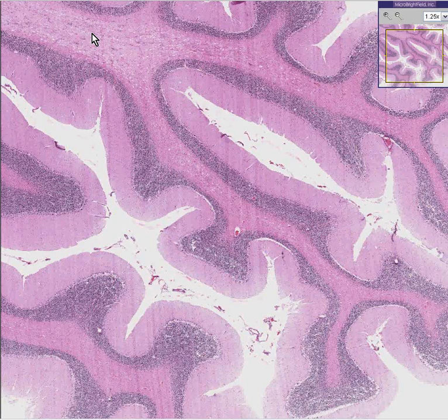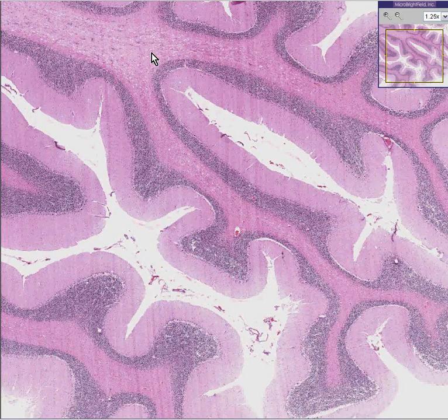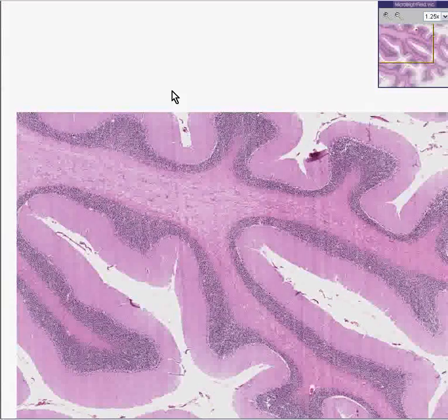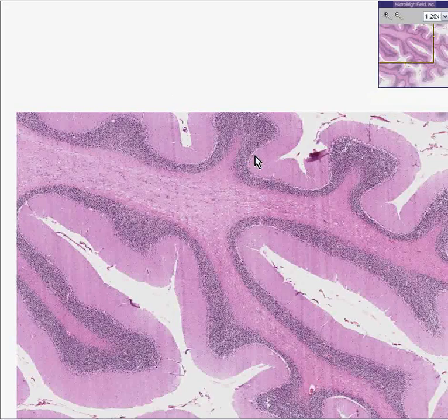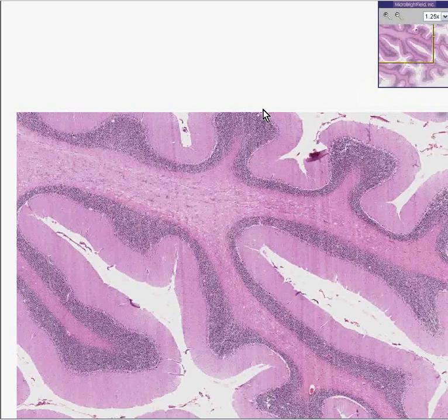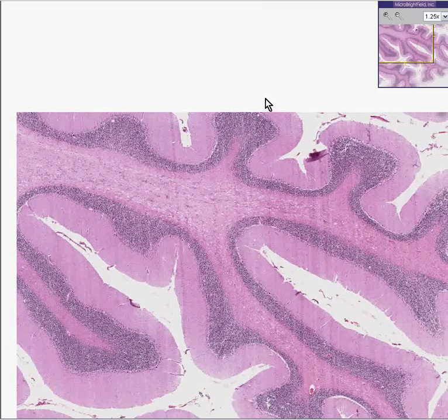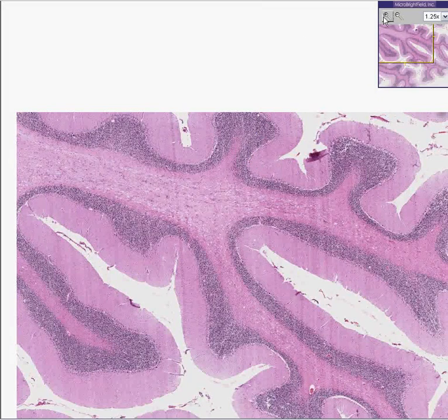This is absolutely classical cerebellum, but it's not normal cerebellum. And I'll tell you why.